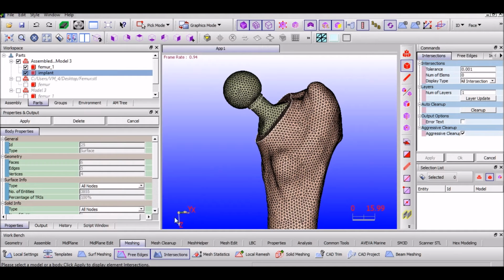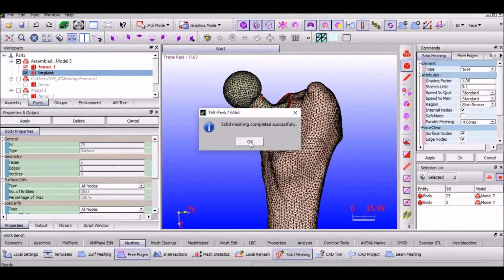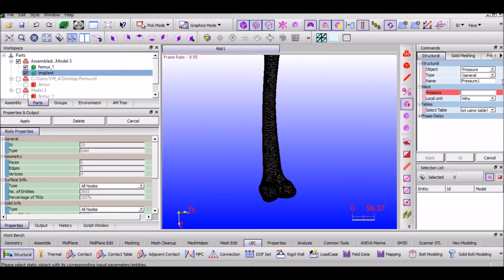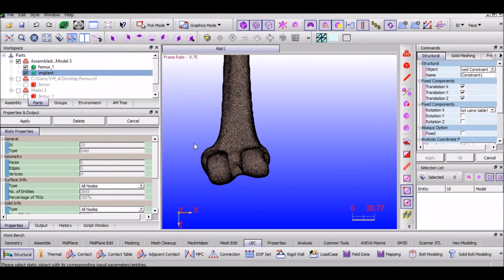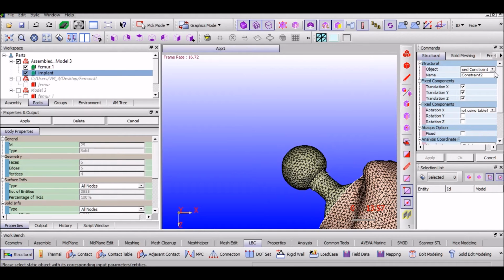The next step is solid meshing. That is, the surface model needs to be converted into a solid body. Under solid meshing, select type as TET4 and click apply. Since solid meshing has been completed, the next step is to assign forces and constraints. Under LBC, select structural, select fixed constraint and select nodes on the lower end of the femur. Click apply, and hence a fixed constraint is applied at the lower end of the femur.